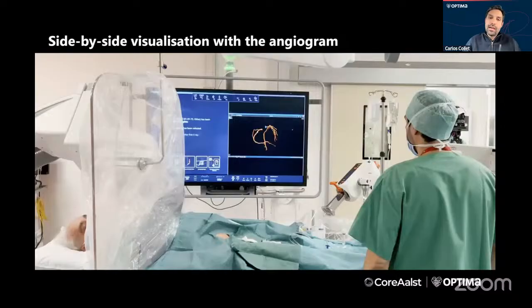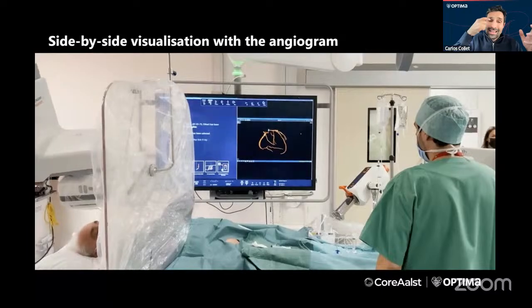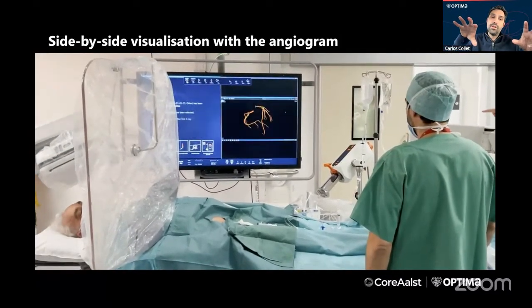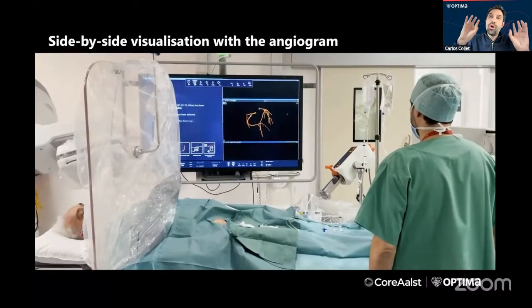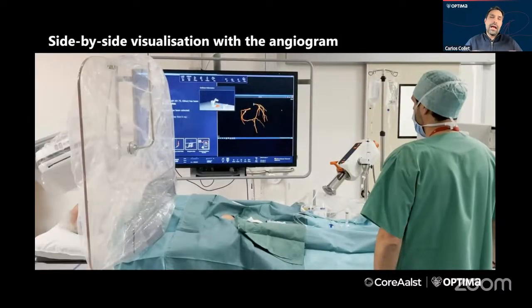Now, what we're doing in the trial, because I have to say we're almost finishing the P4 trial, is that we are putting these geometries, these reconstructions, inside the lab. And these geometries are synchronized with the C-arm. So every time that you move the C-arm, you will know exactly what you're going to see in the angiography without putting your foot on the pedal. And of course, you can imagine the consequence of that. You'll basically be reducing radiation and contrast directly.